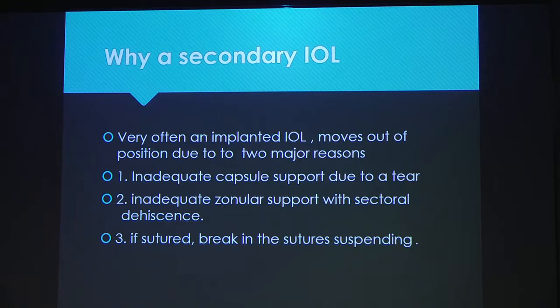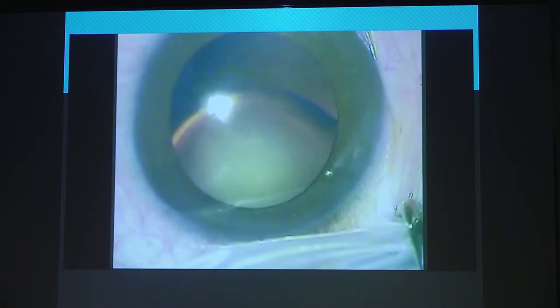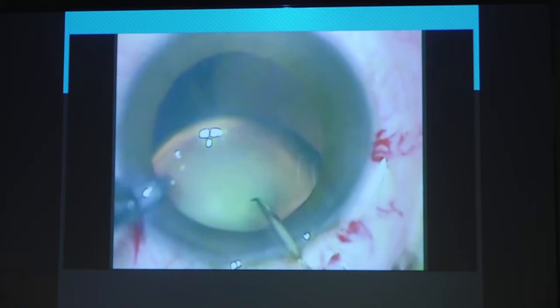If the capsule is intact but the shift has occurred due to inadequate zonular support, the best technique is to stabilize the IOL bag. Let me show you this method — it's known as the back-to-the-wall method. It's a simple technique, easy to do. Here you have a nice subluxated cataract — as subluxated as you would want it. You get up in the morning and see this cataract and your heart is happy that you have fun and games today.